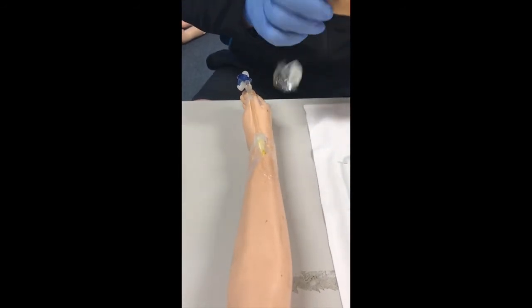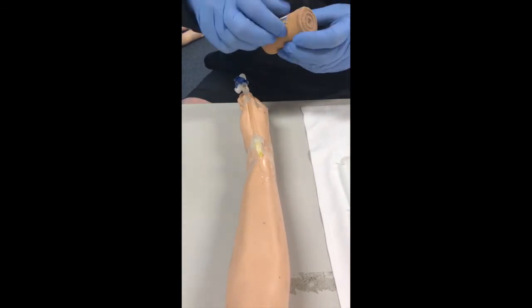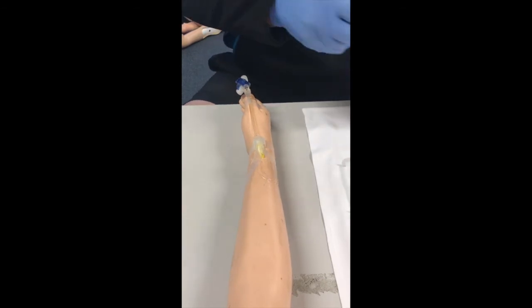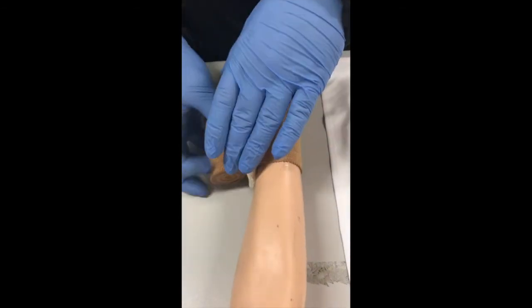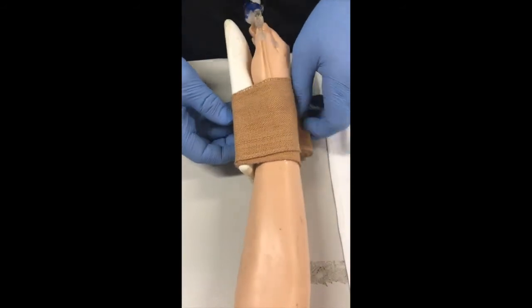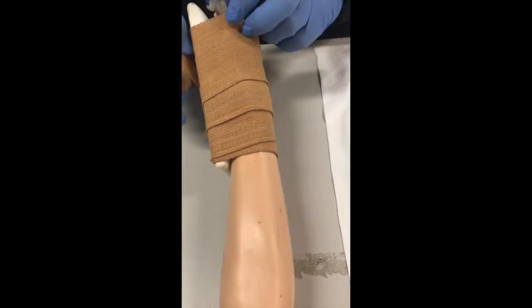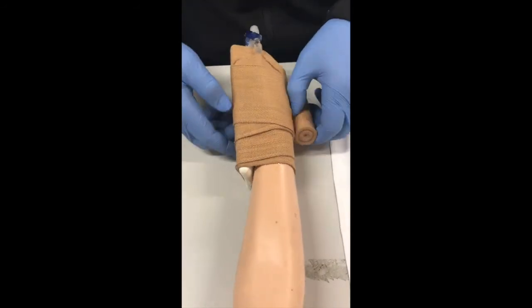Once the cannula has been secured, the patient's arm can be splintered using an arm board and some crepe bandaging. This can assist with movement from the paediatric and dislodgement of the cannula. And it can be formed like so, with the end of the 3-way extension tubing accessible for medication administration.